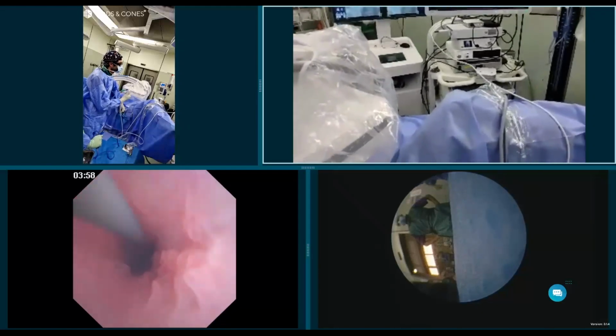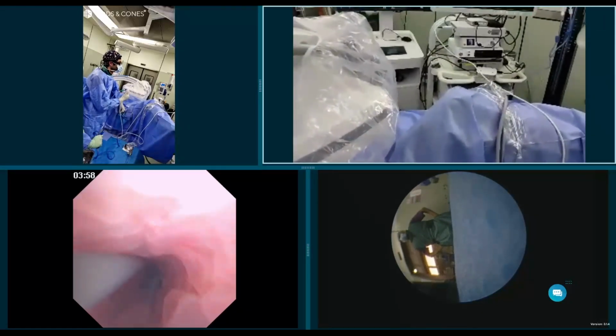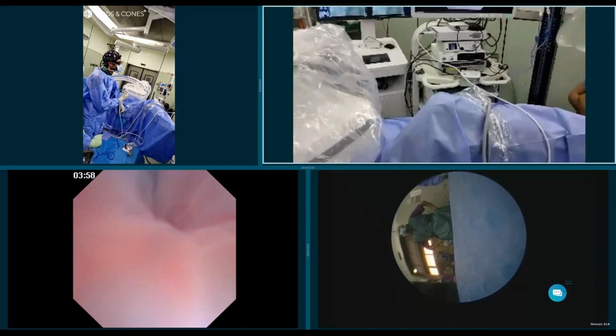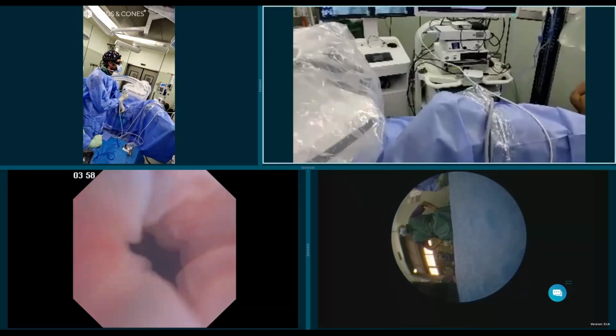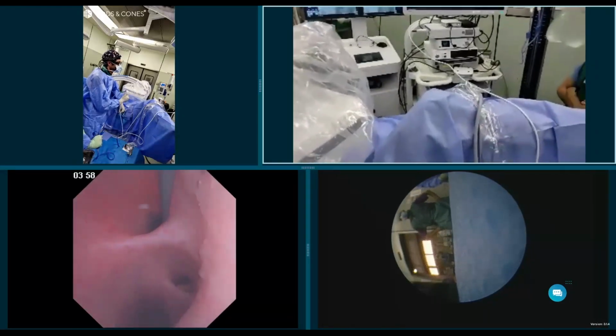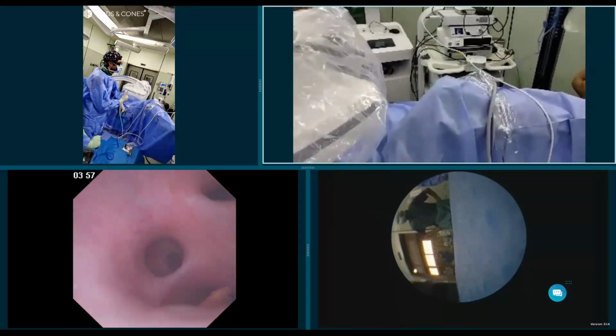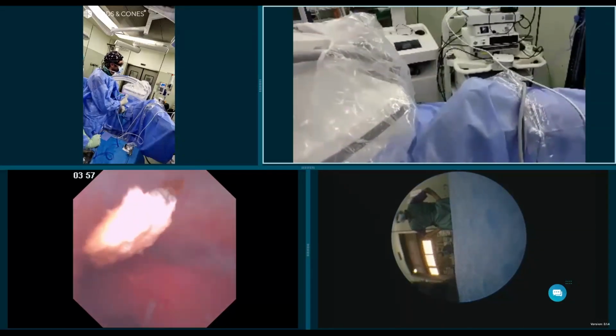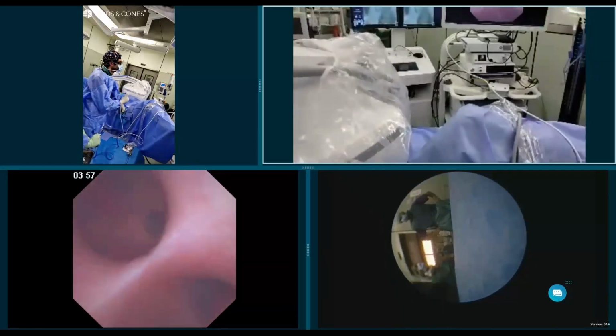So the ureter looks good. Now you can see that the guide wire was well placed. We haven't done any clear X-ray, just one to place the catheter. So we have the lower pole stone here, looks like a struvite stone, perfect for this.